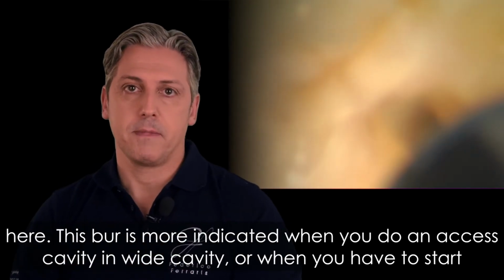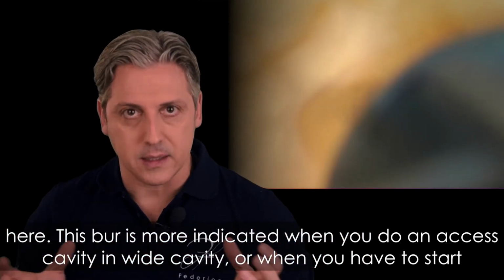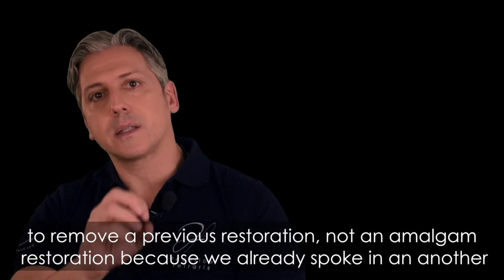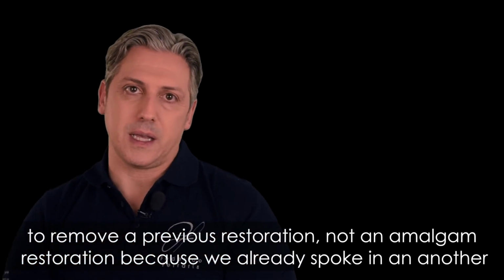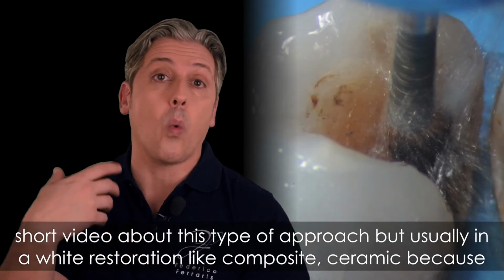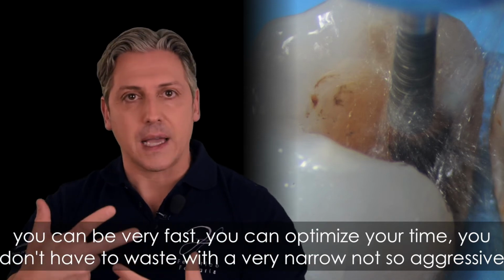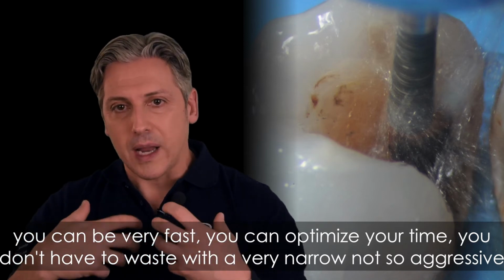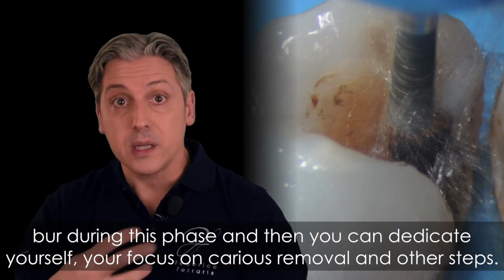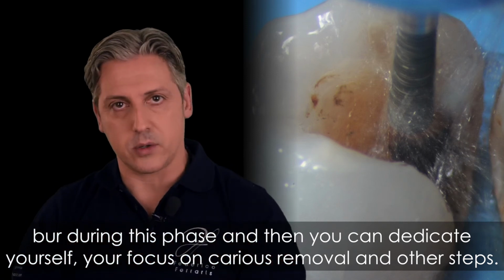As you can see here, this burr is more indicated when you do an access cavity in a wide cavity, or when you have to start to remove a previous restoration. Not an amalgam restoration, because we already spoke in another short video about this type of approach, but usually a white restoration like composite or ceramic, because you can be very fast, you can optimize your time, you don't have to waste it with a very narrow and not so aggressive burr during this phase, and then you can dedicate your focus to caries removal and other steps.